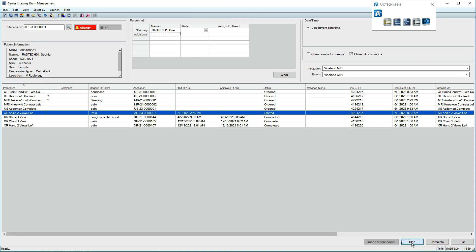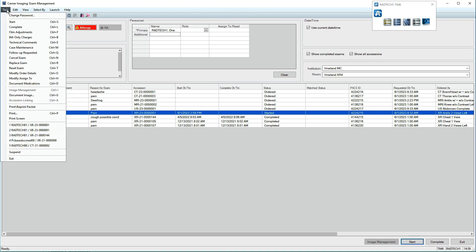If you intended to begin the exam but it has to be stopped, or if the location has changed, you can reset it. In the upper left, click Task, then Reset Exam.